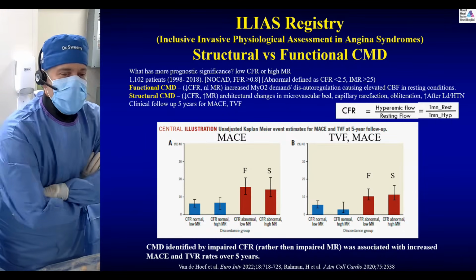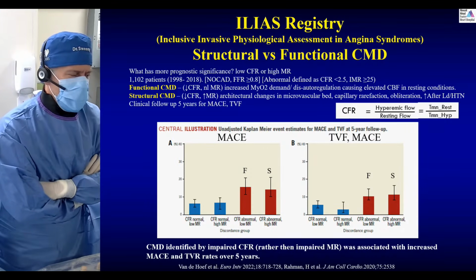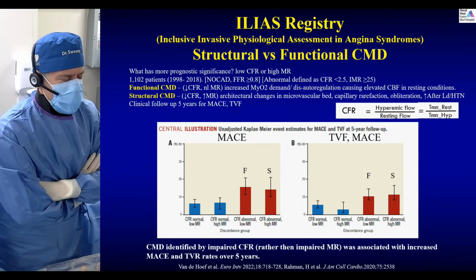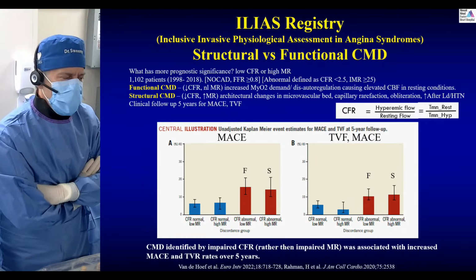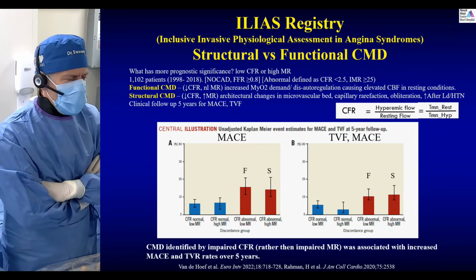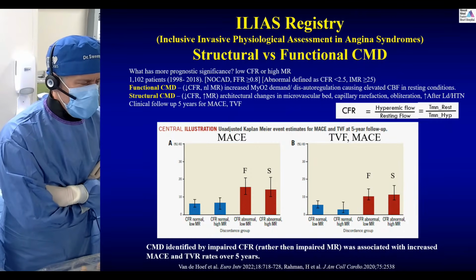And then my last slide before we get to the testing is looking at some of the variances that we get with the non-endothelial adenosine testing. And some of the confusion that comes is how do we interpret low CFR, high IMR, and vice versa? And what we've seen is there's some nomenclature out there now termed functional and structural coronary microvascular dysfunction. And functional coronary microvascular dysfunction is, by definition, a low CFR, but with normal microvascular resistance.